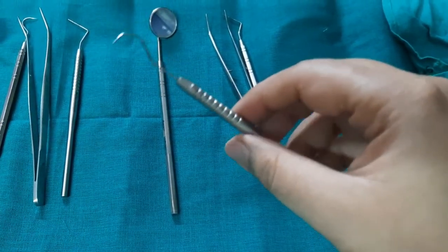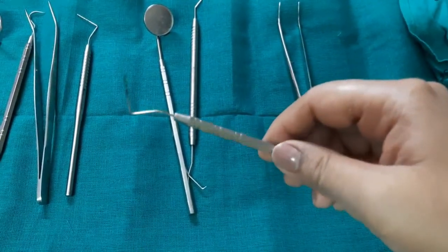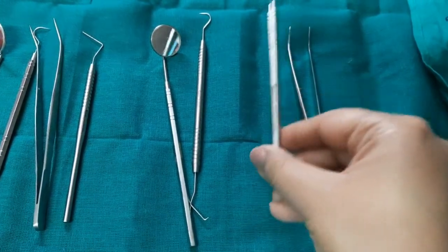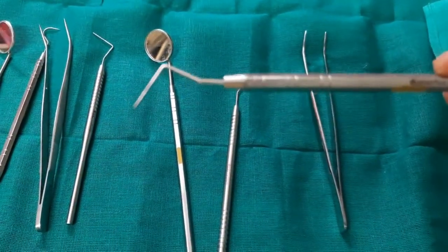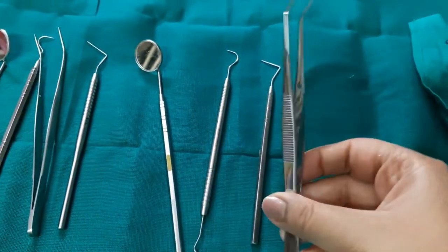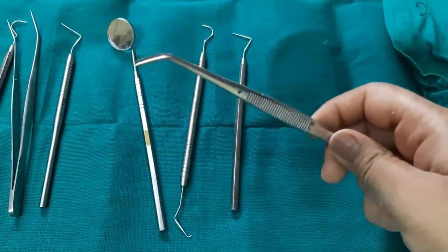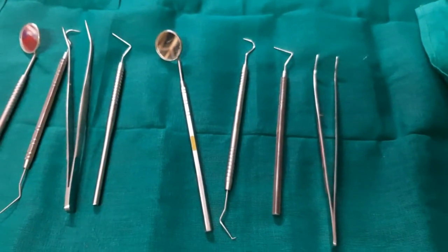Next we have the periodontal probe known as the Williams probe. I will talk about periodontal probes in more detail after I finish the diagnostic instruments. The Williams probe is one of the diagnostic instruments and also a periodontal probe. The last instrument in this diagnostic set is the tweezers, with which you can carry cotton and remove any debris like broken calculus. That is all about the diagnostic set.